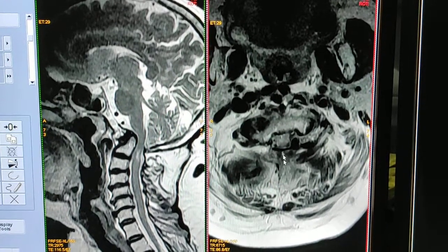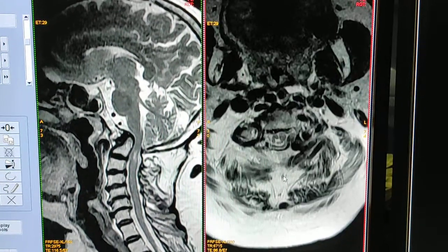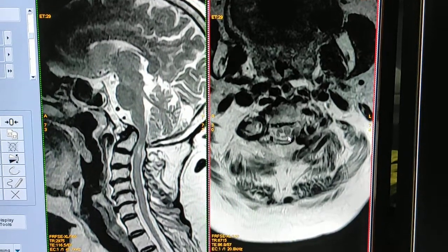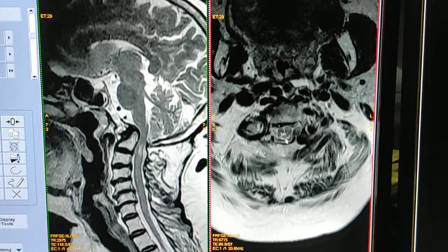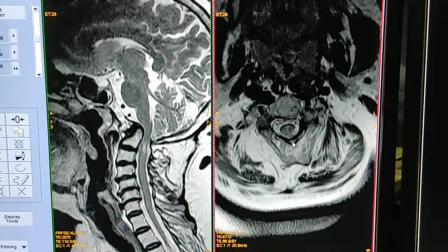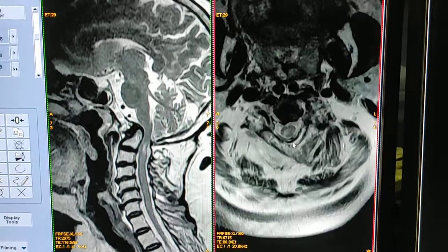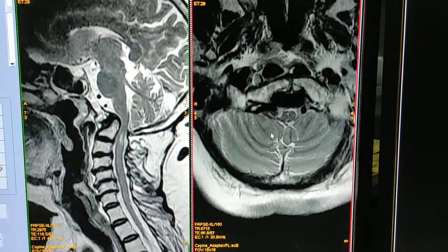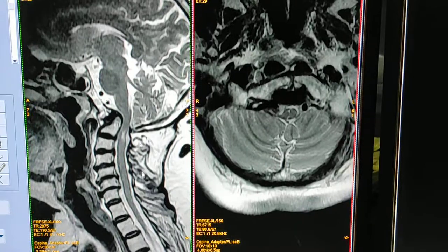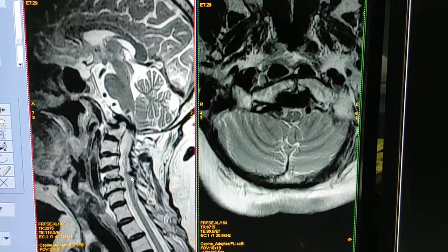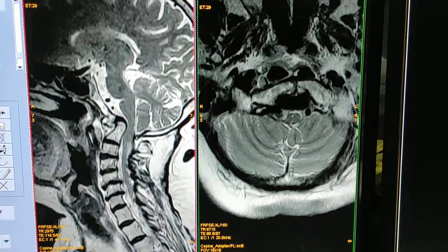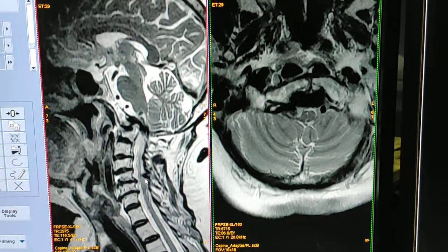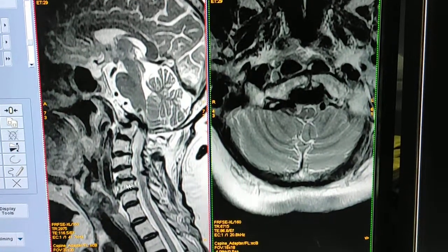You can see this signal in the cervical spinal cord. From this type of picture you can make the diagnosis.